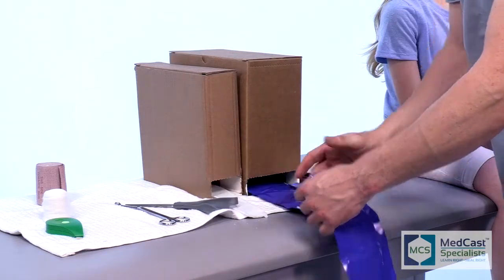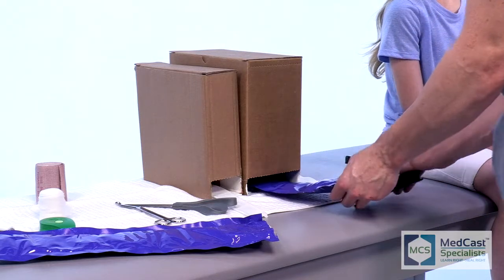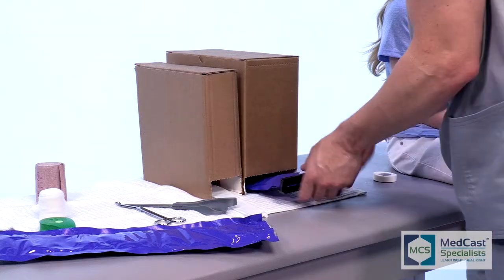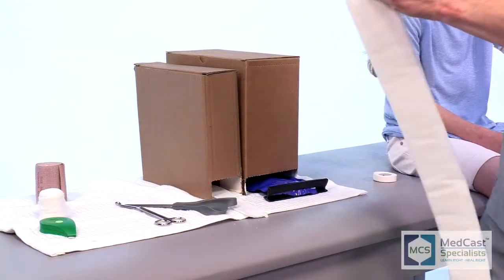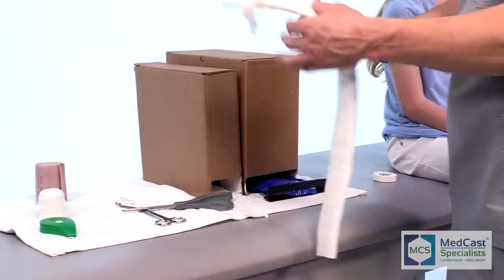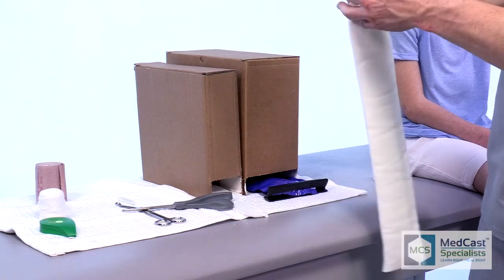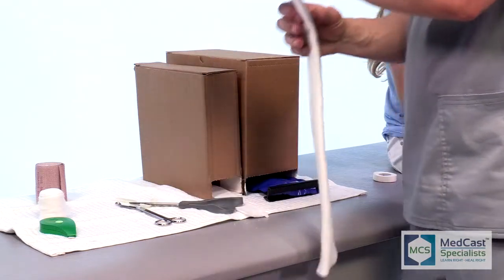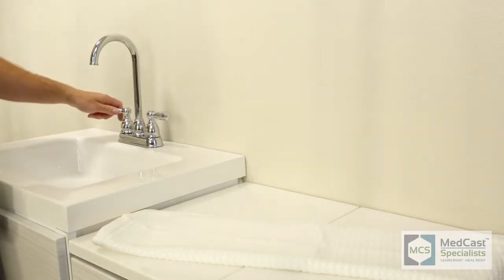One thing we see a lot is sugar tongs coming in that are way too long — they extend volarly and dorsally to the fingertips. Sometimes they go past the fingers, fold them back, and they're still impinging the MCP joints, so the patient can't move their MCPs and can barely move their fingers. That's frustrating for the patient who's trying to heal. If they can flex and extend their fingers, that flexes the muscles, and the muscles help pump out the fluid.